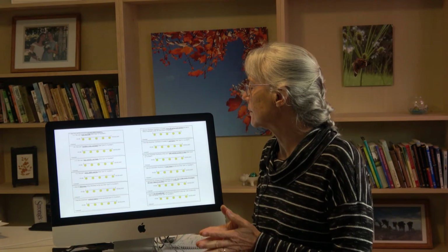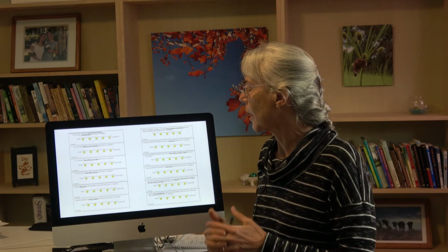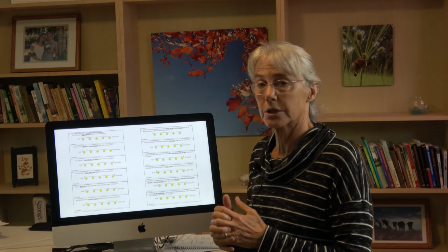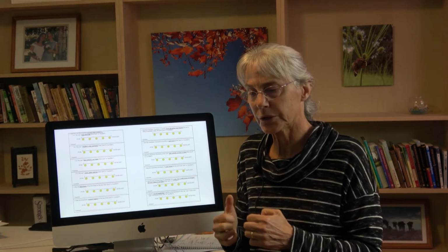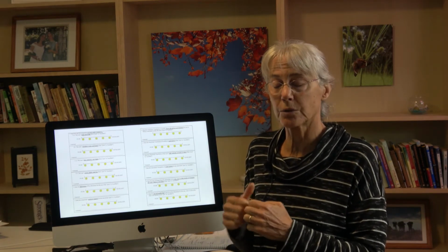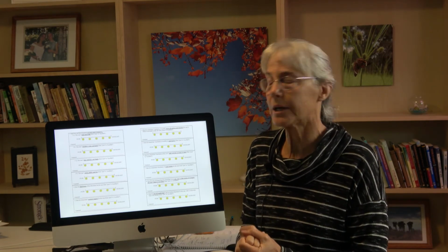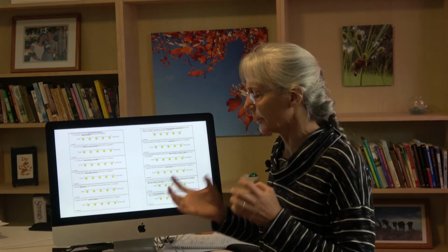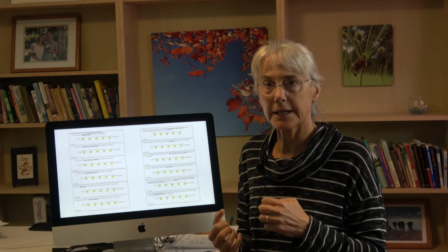Rate the dimensions of this wheelchair for this user. Does it fit them? Rate this wheelchair's postural support for this user. And really only the therapists are the most able to rate postural support. You'll see when we look at the questionnaire that's for the wheelchair users, it's worded differently because they weren't familiar with postural support, the phrase or the understanding that a clinician would have from their training in seating and therapy.